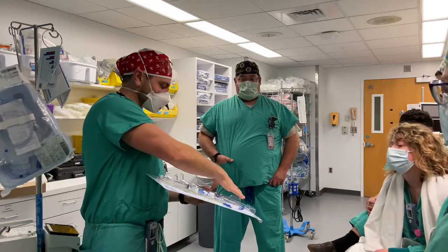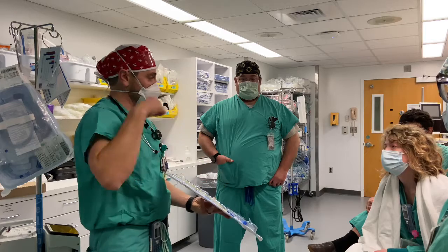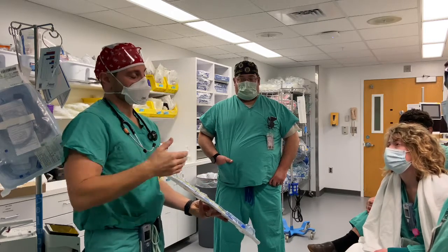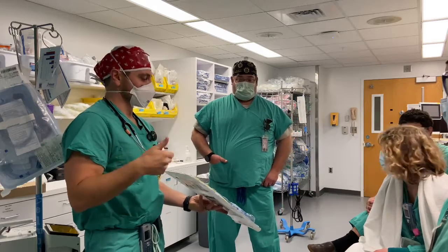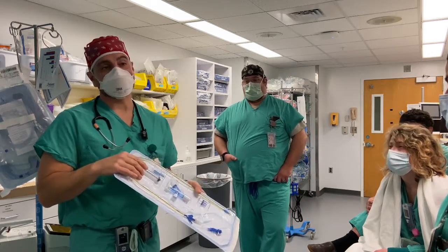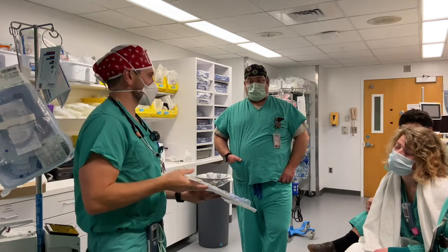Because when you're occlusive here, there is a small port through the center of this that you can either aspirate on or hook to suction to get that lung to deflate, but it's much smaller, so the lung doesn't deflate quite as reliably. So surgeons don't really like these very much because it doesn't give them quite as good of a field of view, because the lung doesn't deflate out of their field of view quite as quickly.